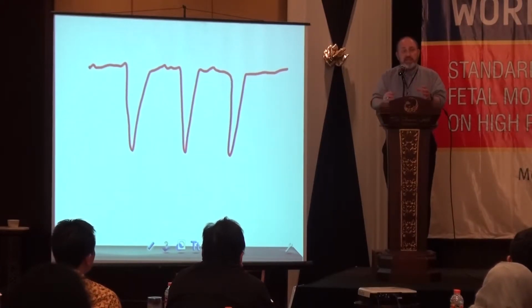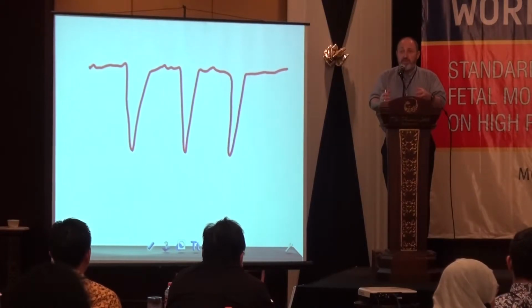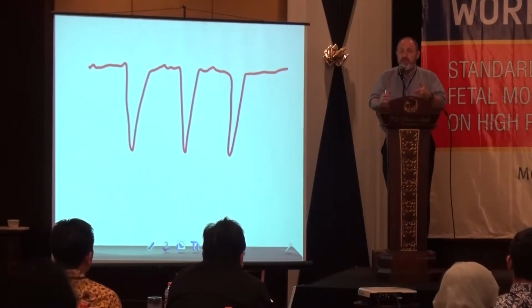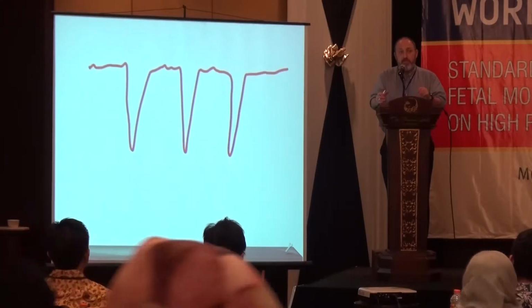Variable decelerations have a varying effect on the baby. So they may or may not be associated with genuine compromise, genuine hypoxia. So the best way of determining how that baby is doing is looking at all the other parameters also. Color of the liquor, the baseline variability, the baseline rate, all the other features which are important for any assessment. They should be very high on your minds when you're assessing how good this baby is.